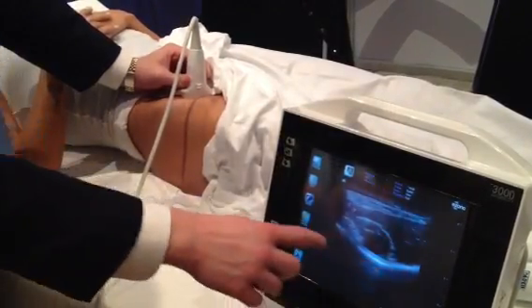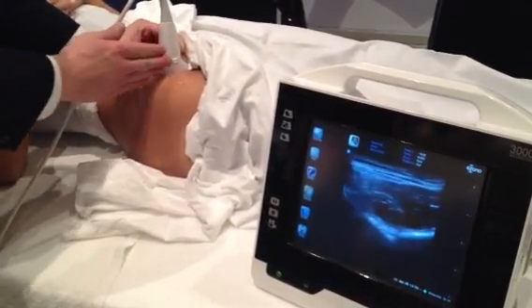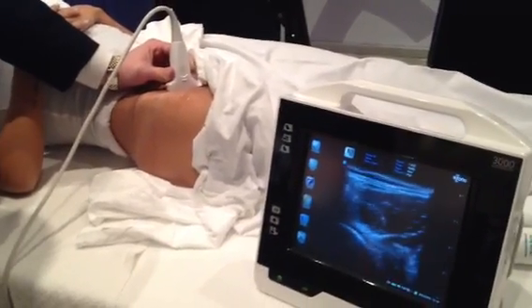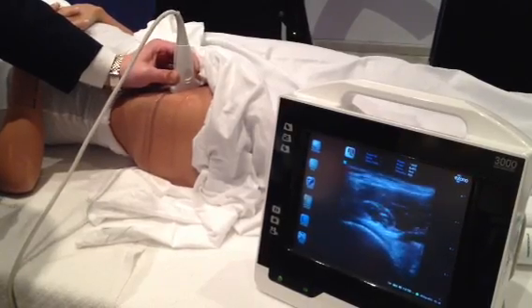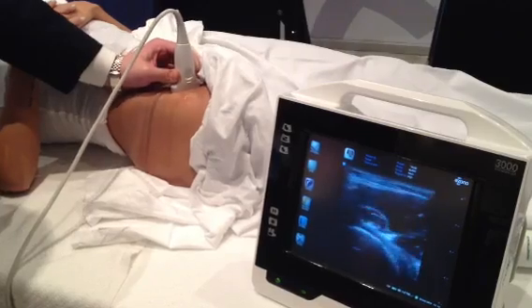I want this crest in the center of my screen, and what I'm going to do is move my probe towards the troc. As I move down, I see the head come into view. So this is pelvis, that's femoral head. Pelvis, head — it's where I start, it's where I want to go.